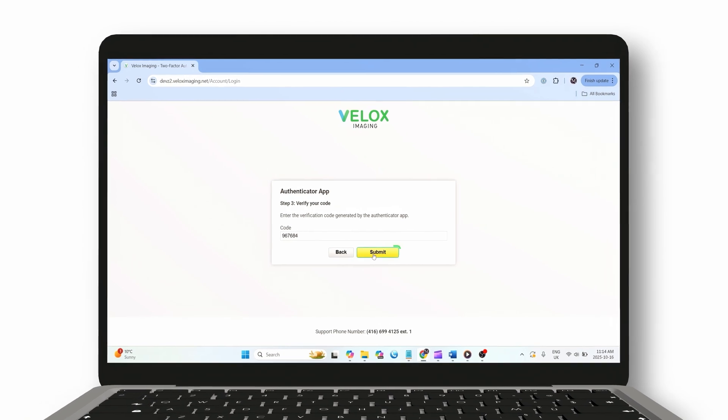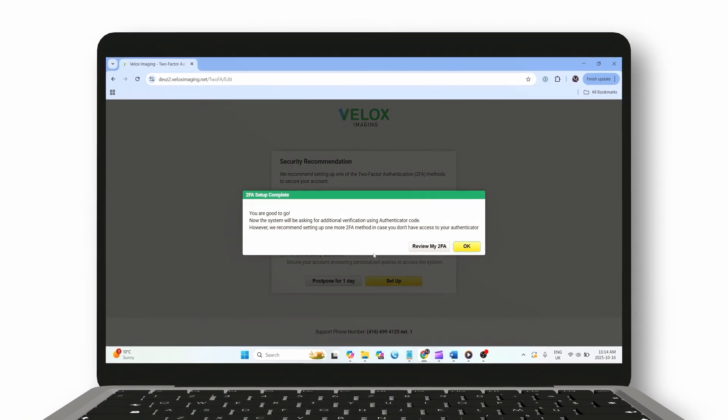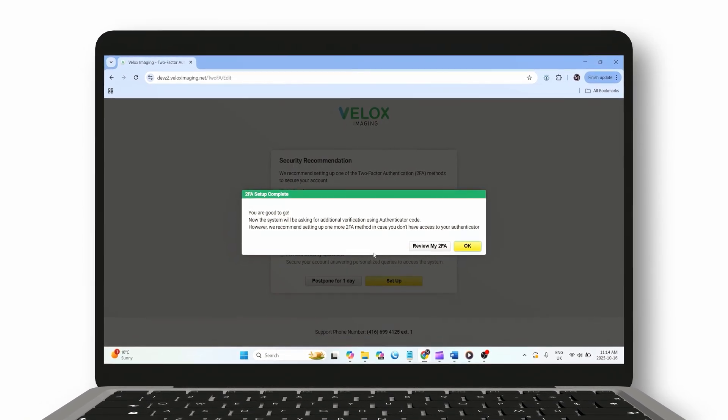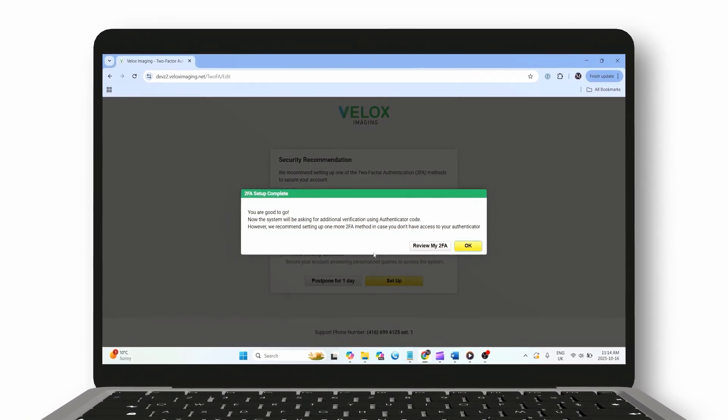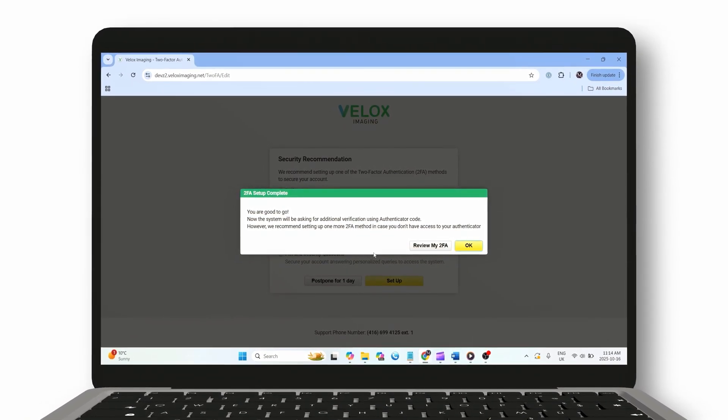Type this code into the field on your Velox Imaging login screen, and that's it. You're all set. You've successfully enabled two-factor authentication for your Velox Imaging account.